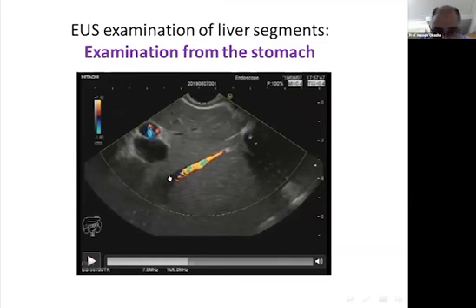The middle hepatic vein is a long vein, and its diameter is homogeneous all over its course, from the inferior vena cava to going deeply inside the liver. So it has the same diameter. And another landmark at that level of the middle hepatic vein, I can see very nice fibrous ligaments, which is the ligamentum venosum, communicating the inferior vena cava to the left portal vein.